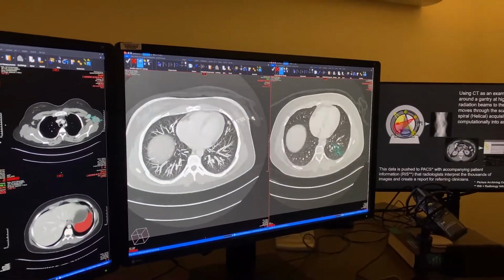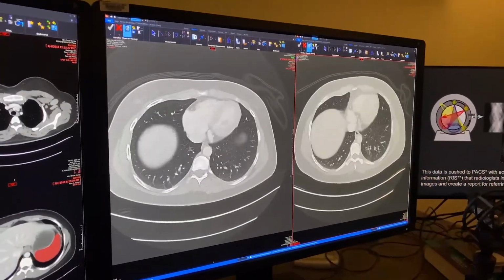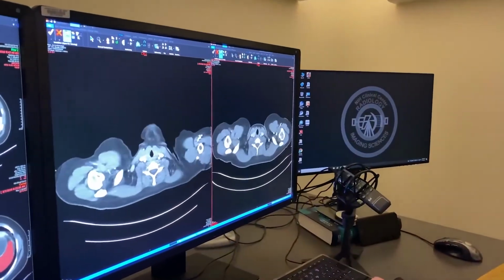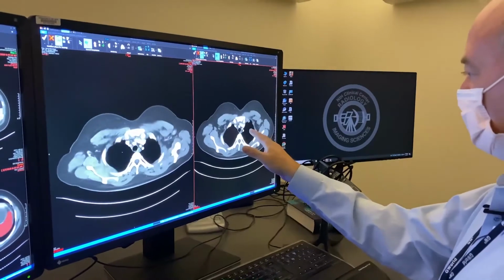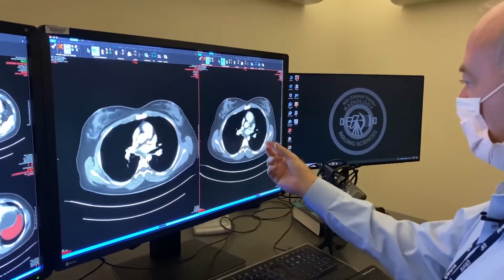Now we can go into the view, get into a little more detail. We generally look at everything in a 2x1 overlapping thin, 2x1 millimeters overlapping. So starting from the top, now we've gone through the lungs, we've gone through the bones. So now I'm looking at thyroid, making sure that's all symmetrical. You can see the lymphadenopathy. Here's the aorta, pulmonary arteries.